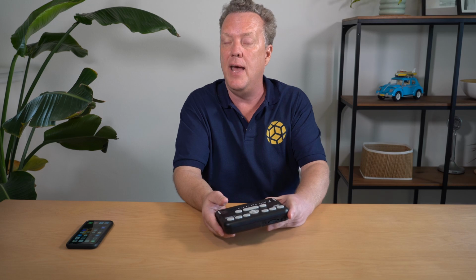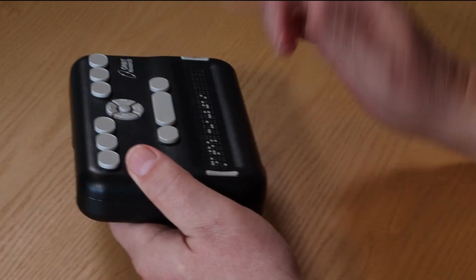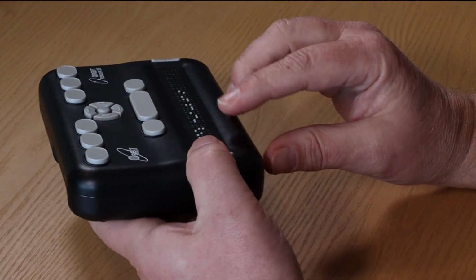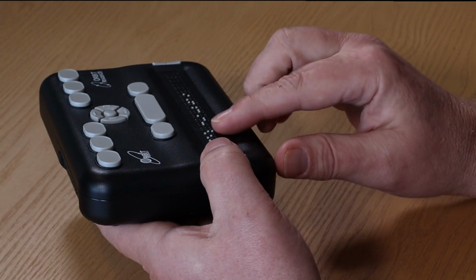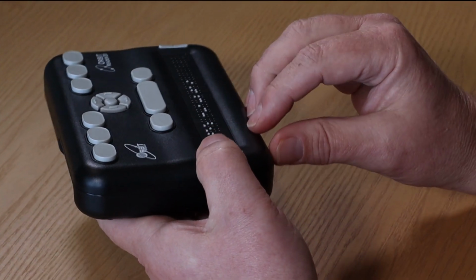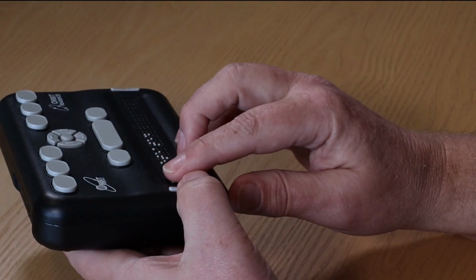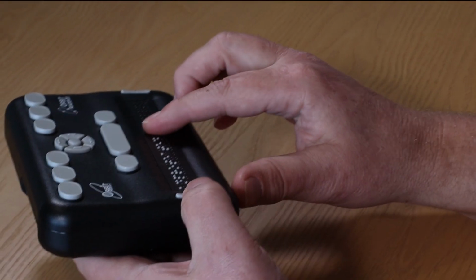And now I want to show you something else that's cool with an iPhone or a device today, and that is a Braille display that I have right here. So if you can see here, it's got Braille that reads what I have focused on the screen over there. And with this button here, I can scroll around and change the focus and watch as new pins come up, and listen. Let's go down. There you go. You heard that, and new pins come up, and I can read new words in Braille right here.